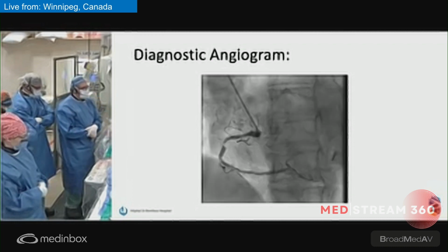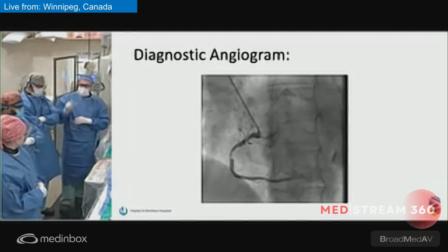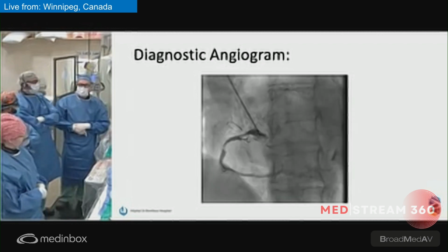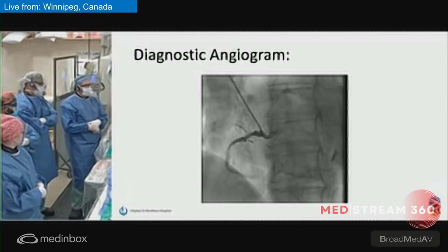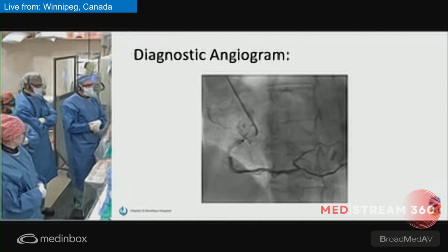Today, our team: Dr. Cass is with us, Arjun, our fellow, Sheila is nurse, everybody else is here, and we'll hopefully start. Our plan today was to primary wire first, see if we can actually get a balloon in there, open it up, and at least do some imaging to see what we're dealing with, and then subsequent to that, go with our 1.5 burr.